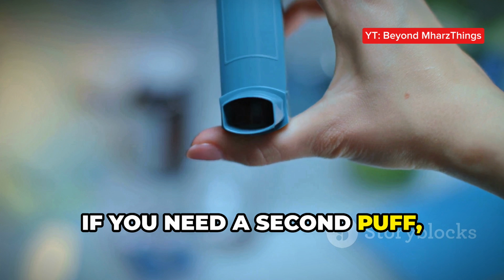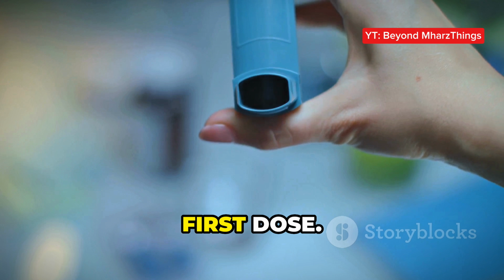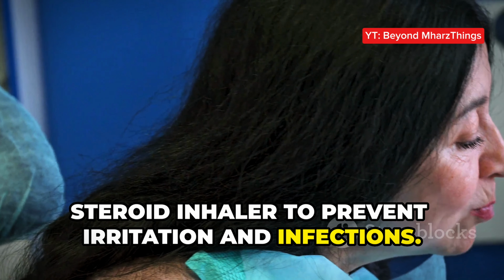If you need a second puff, don't rush. Wait about a minute before repeating these steps. This gives your lungs time to absorb the first dose. And don't forget, always rinse your mouth after using a steroid inhaler to prevent irritation and infections.